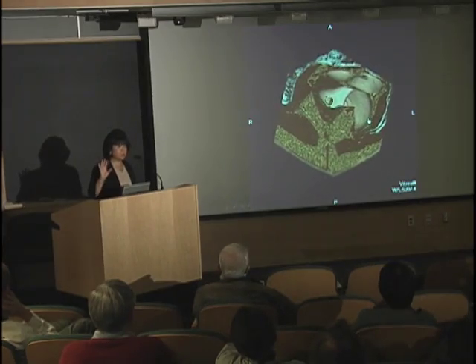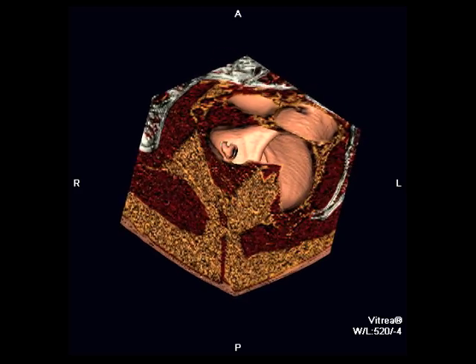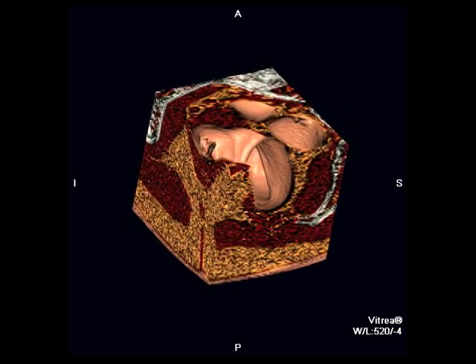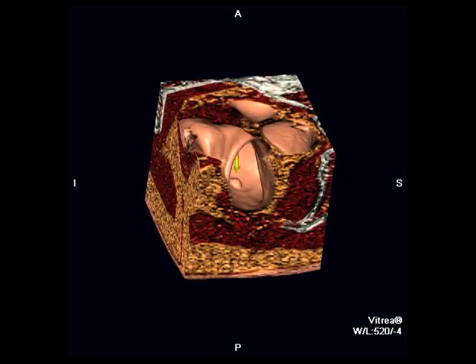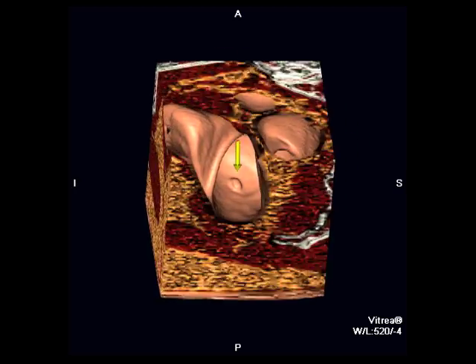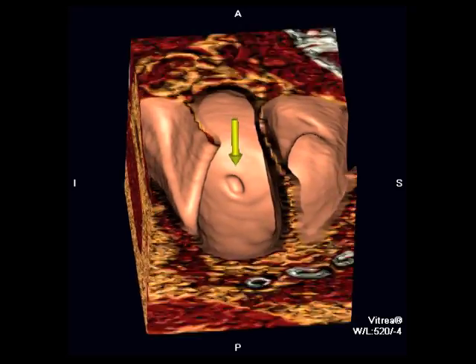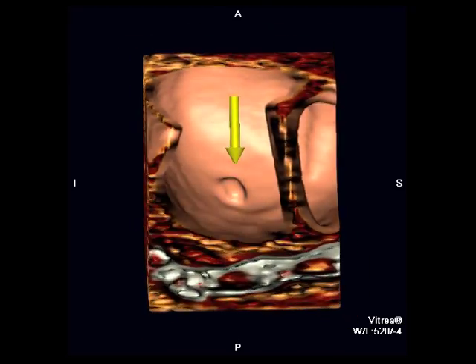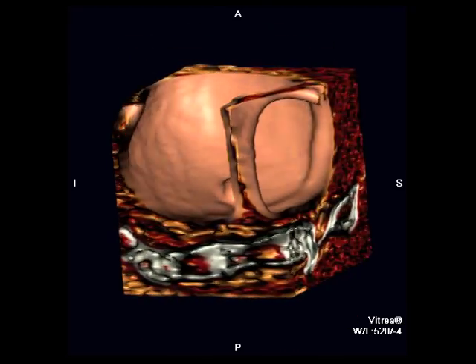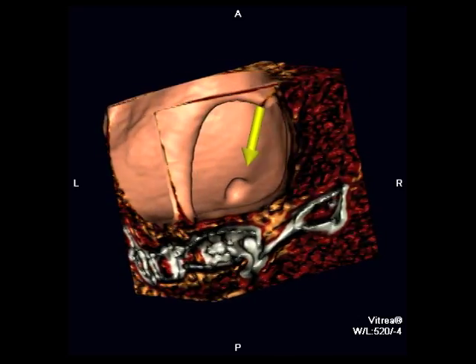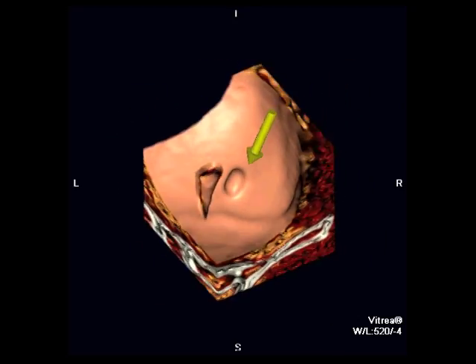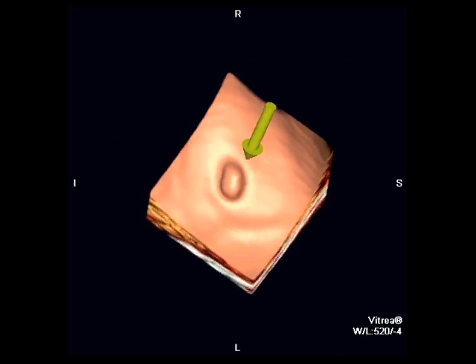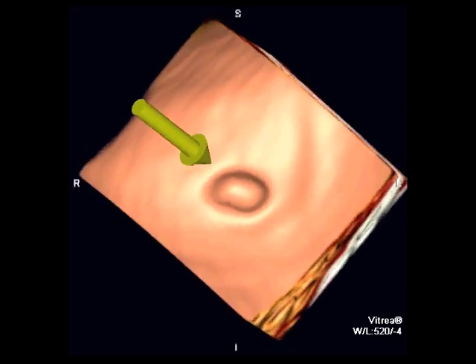We're able to manipulate the data in 360 degrees, so we can easily roll through the wall. And here's a polyp — we can rotate in any way. And this is, again, at no additional radiation.